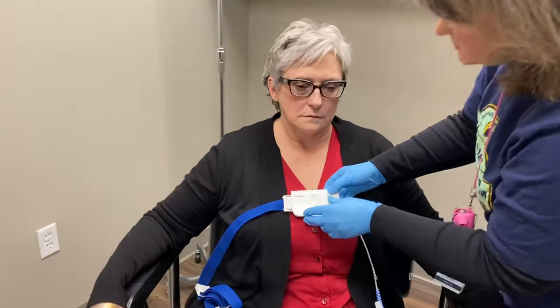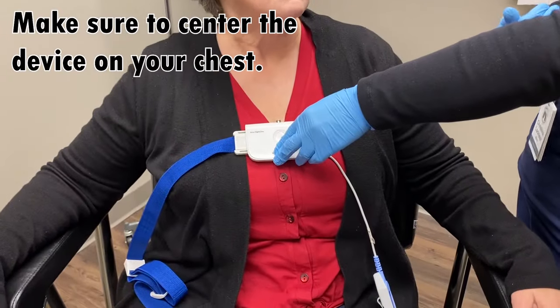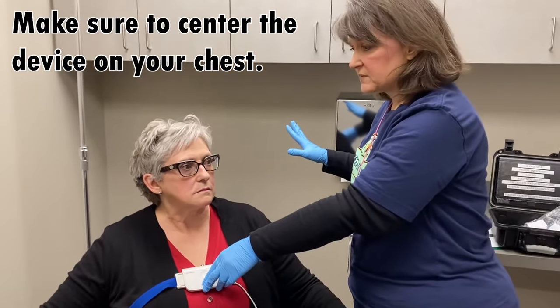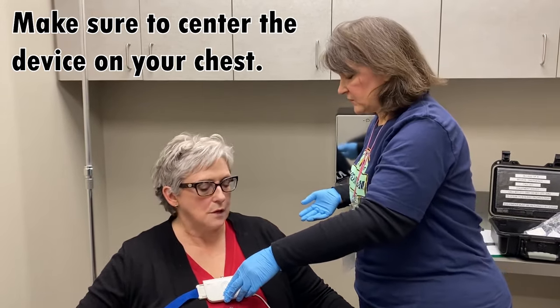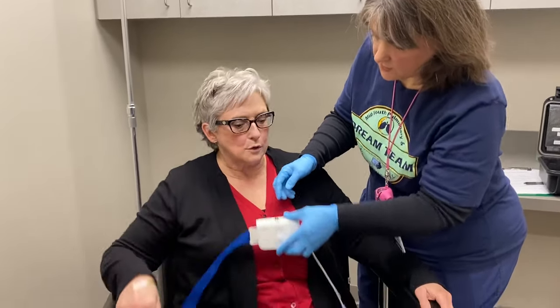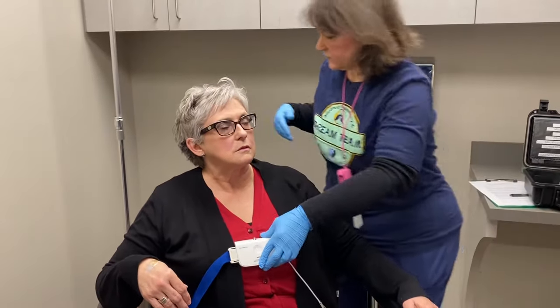The reason it goes in the center of your chest is because the doctor is using it as a position sensor. By doing that, you can sleep in whatever position you like — it's just something that the doctor finds helpful in diagnosing your problem. If it's more comfortable, you can slide it under, above, or centered, but the main thing is to have it centered this way.